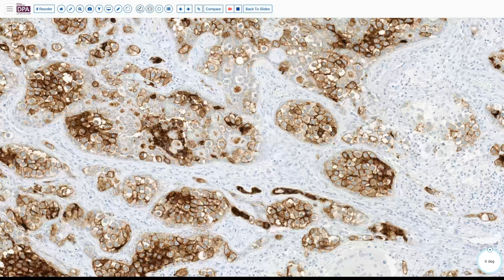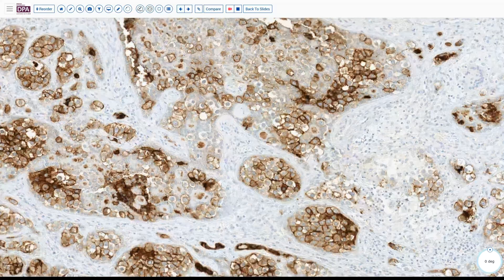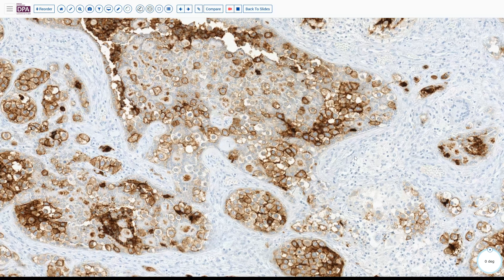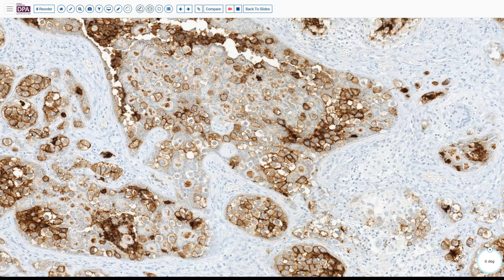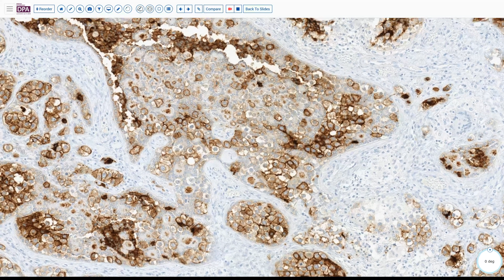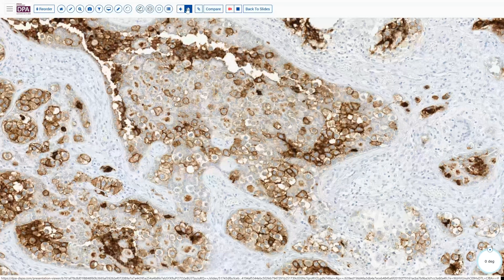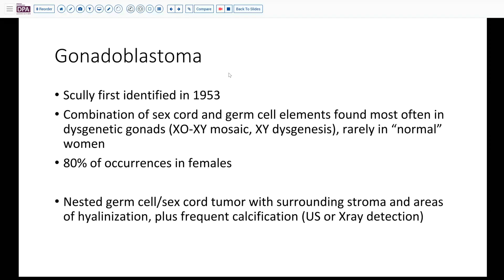If we were to perform stromal cell markers like calretinin or MART-1, we would also see differential staining of the stromal component, with negative staining of the germ cell component. Based on that, our diagnosis is a gonadoblastoma.